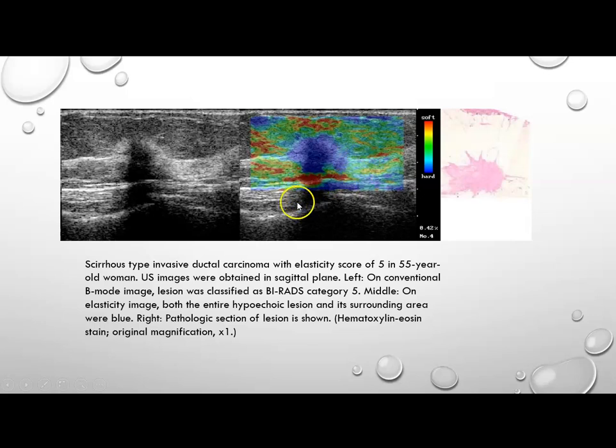And they have found that elastography is very well correlated to actual pathology specimens as far as denoting the size and shape of the tumors. So it is very good. This is definitely the grayscale is underestimating the size of the tumor. Elastography is showing you the size of the tumor, and then over here we see the pathological specimen of this very same tumor.